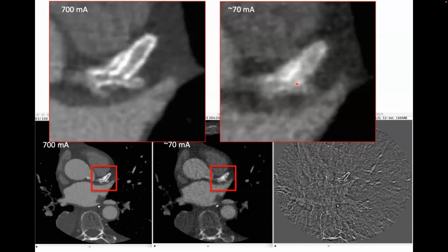But we've used them for this: if we have a small phantom that we image in our clinical scanner, and you want the underlying truth of the dimensions of the object, you can put that into essentially an ultra resolution CT scanner and get that underlying truth, right? By a factor of 10 or something.